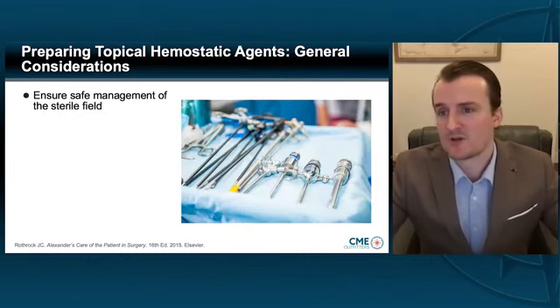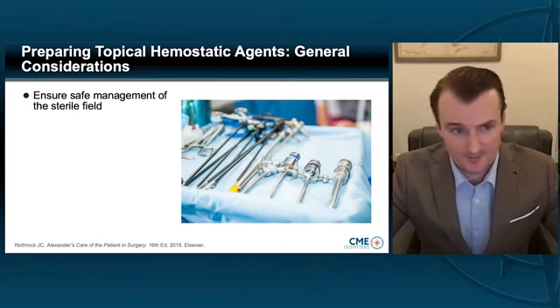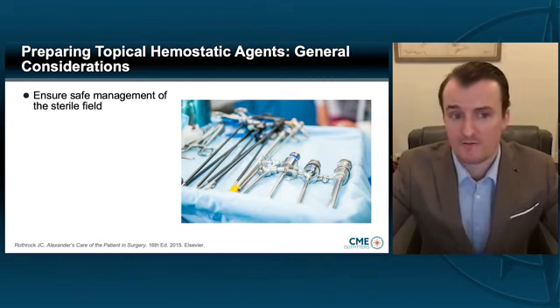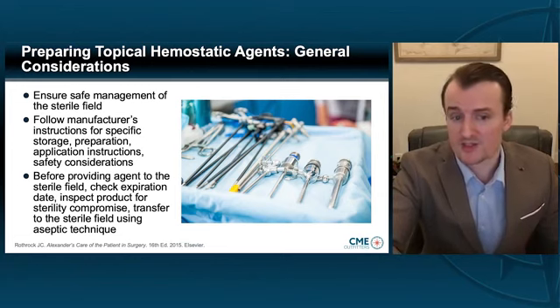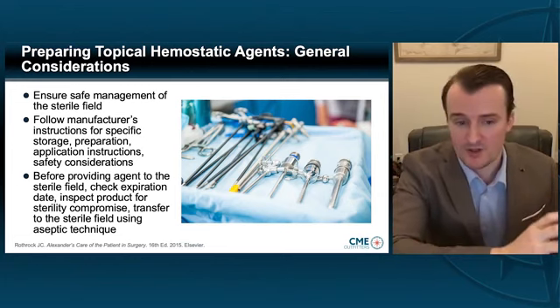So there are some general considerations for preparing topical hemostatic agents, and ultimately, we want to make sure that there's safe management of the sterile field. We want to follow the manufacturer's instructions for the storage and preparation, and we also want to prevent us from using expired products, right? There's expiration dates on the box that we use before we prepare it. Michael, did I get that right? Absolutely. Every single one of those are very important, from checking the expiration date to proper preparation of these products.